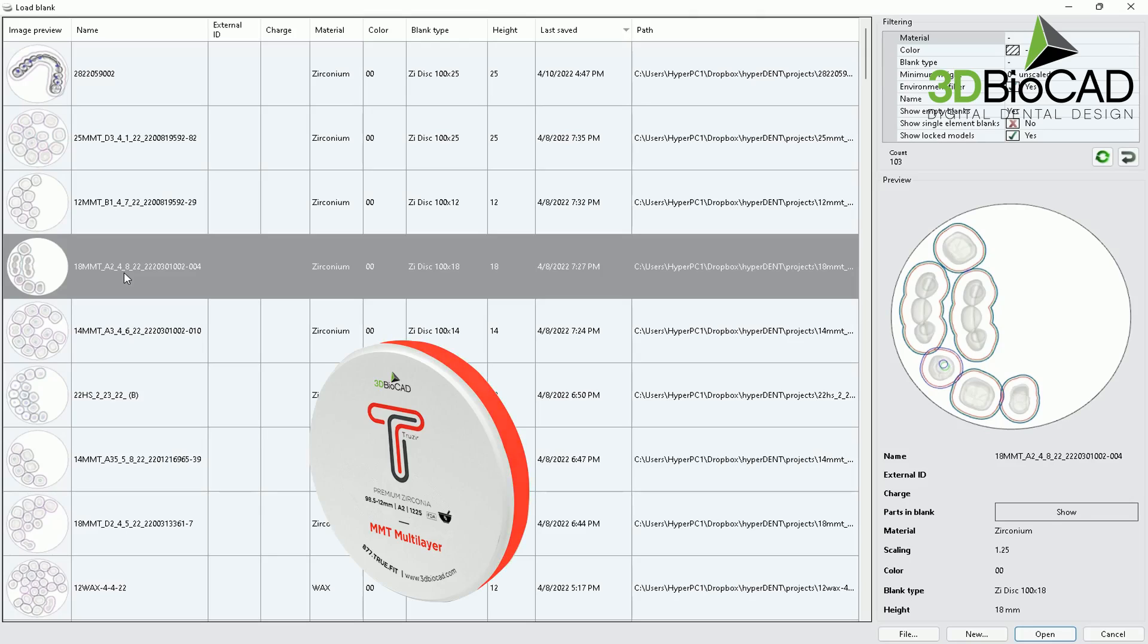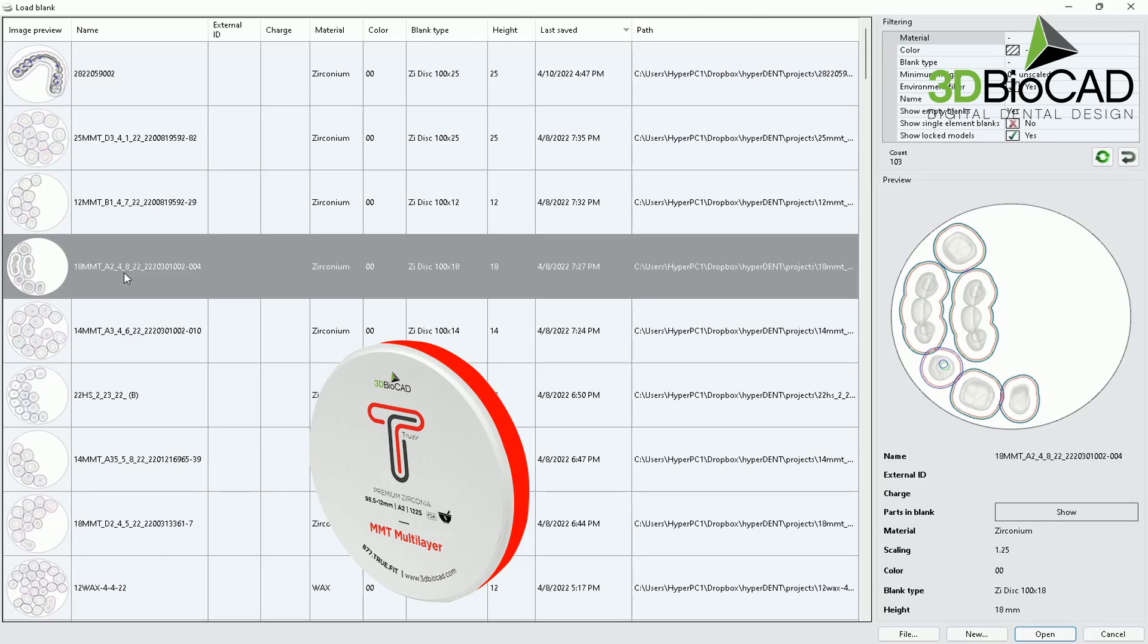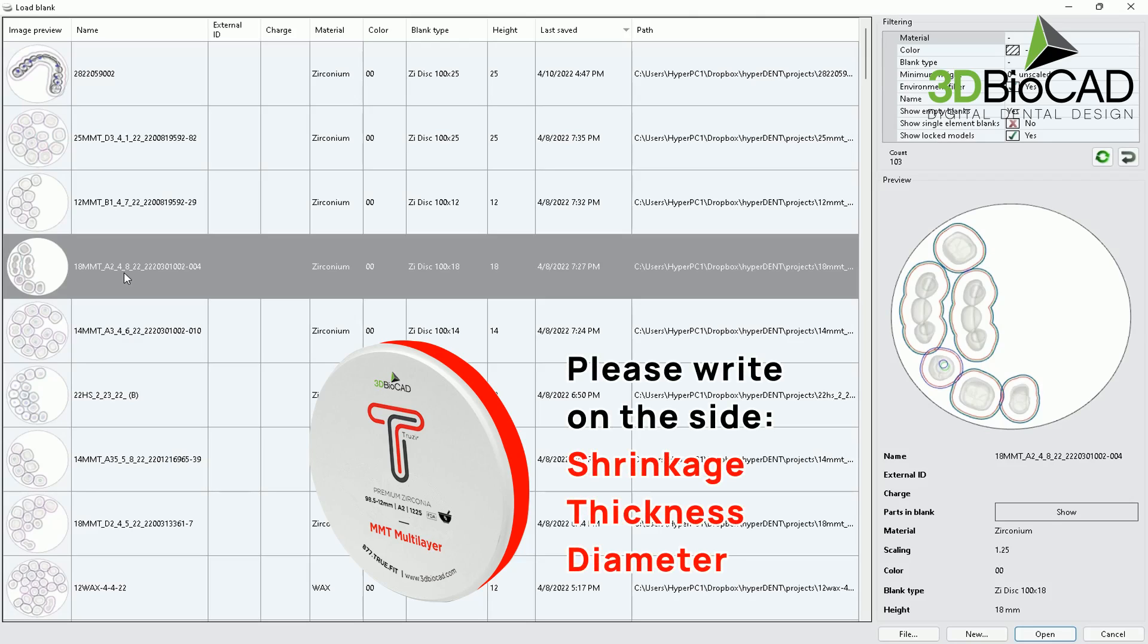On the side of the zirconia blank, if you can use Sharpie to write down, it will be much better because any letters on the top of the zirconium, after the machine mills, it will disappear. So sometimes you might not know what kind of shrinkage, height, or size of the zirconium that you were using before. So make sure using Sharpie write on the side of the zirconia blank.